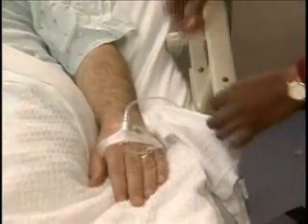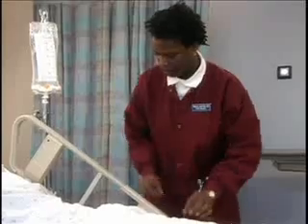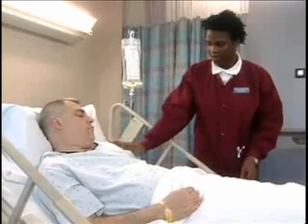Make sure that all the connections in the system are tight. That's right. And also check to see that all the clamps are open, and check the roller clamp to adjust the rate if needed. What did we do, Jeannie? Well, we checked to make sure the patient wasn't sitting or lying on the tubing, and that his arm wasn't raised above the level of his heart.